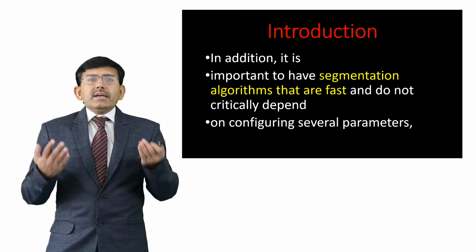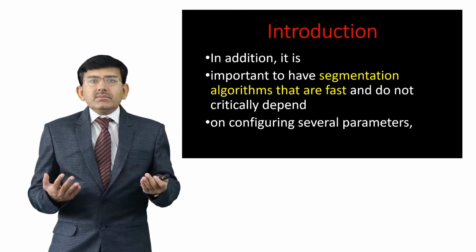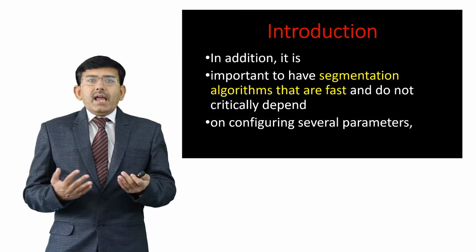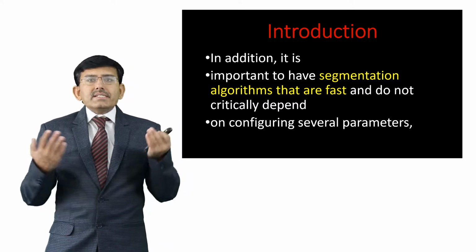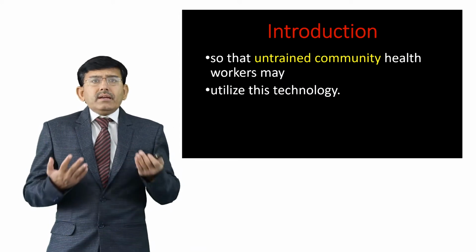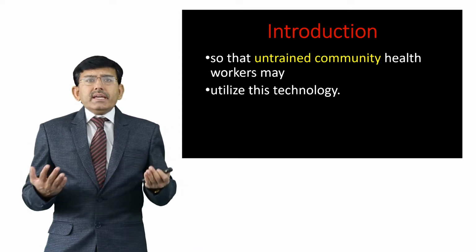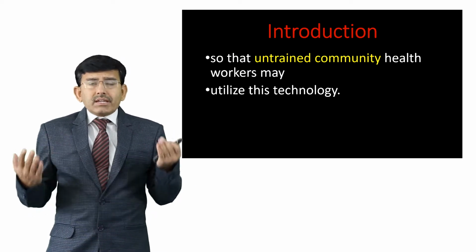In addition, it is important to have segmentation algorithms that are fast and do not critically depend on configuring several parameters, so that untrained community health workers may utilize this technology.